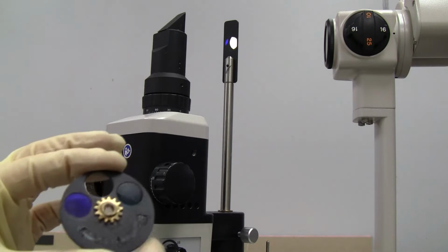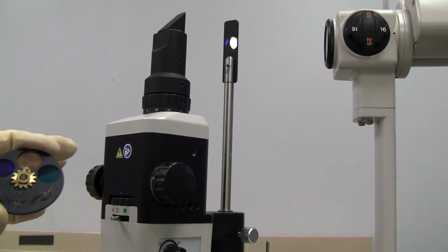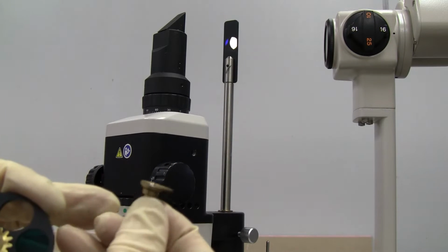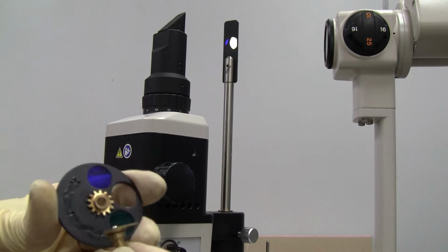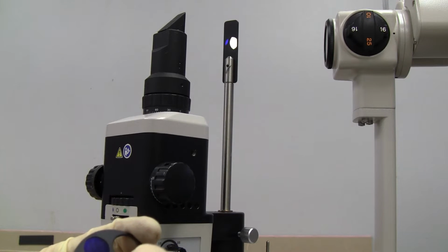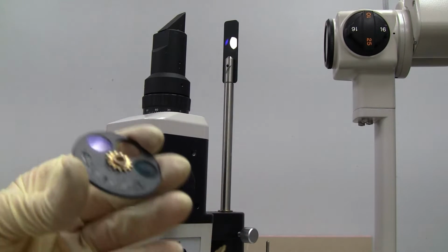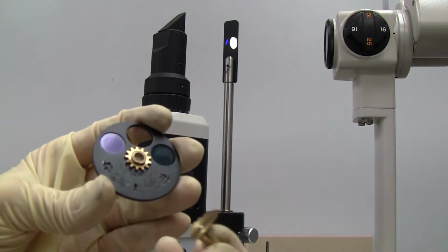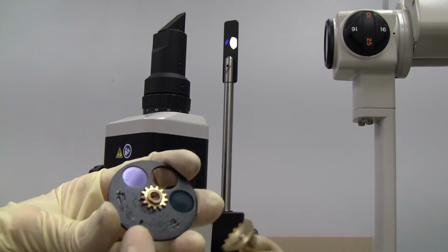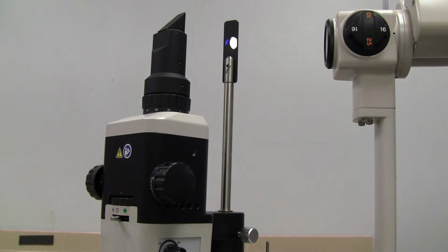Now underneath the filter wheel, it's got little detents under each color, and on top of the gear that the lever screws into, there's a little bearing, and that coincides with the detents. So something is wrong with that. The bearing is not there, or something, or the detents are bad, something. So we're going to have to take it apart. You probably won't have to do this, but this is what we've got to do.